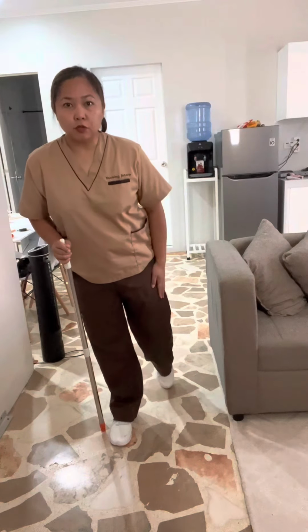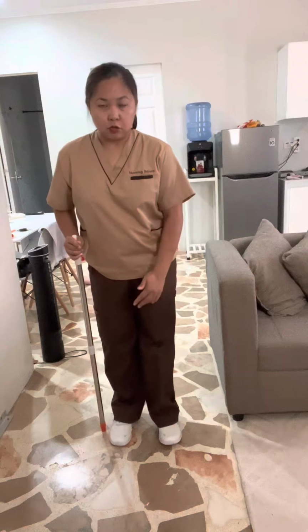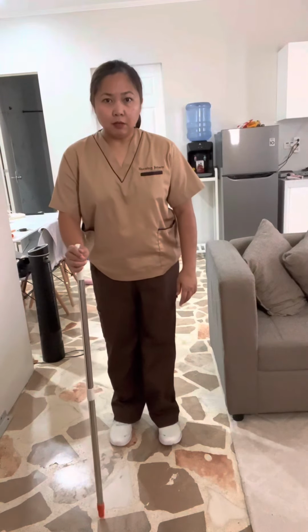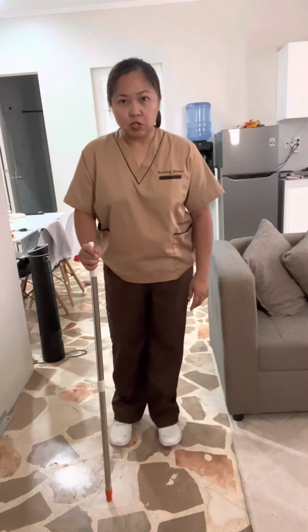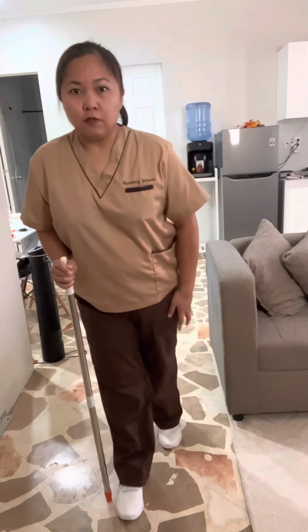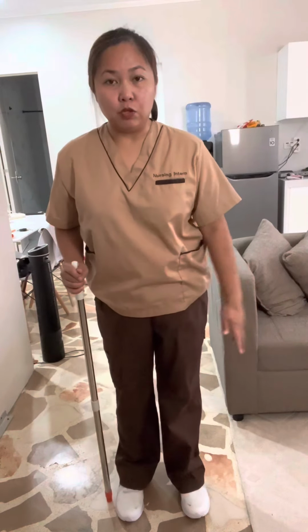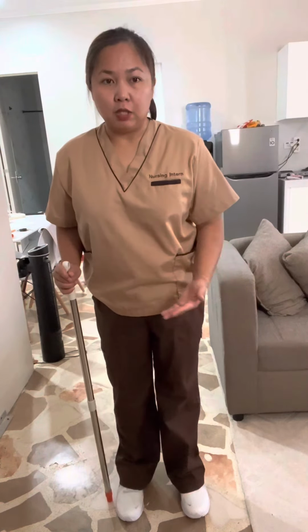And then you would follow through with your weaker leg parallel to the cane and your stronger foot. And then do it again, about 4 or 5 inches, and then a little bit over that on your stronger leg, and then follow through with the weaker leg. Just make sure that the weight is always evenly distributed when the patient is ambulating with this procedure.